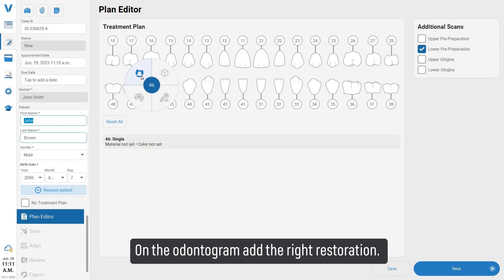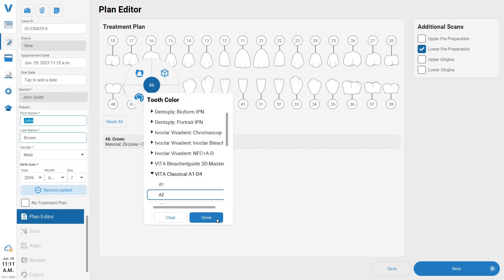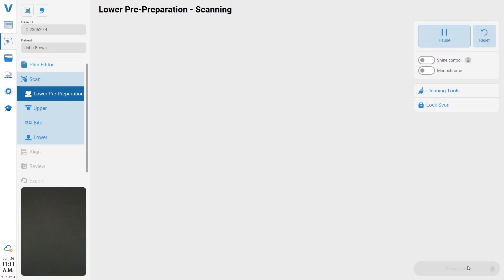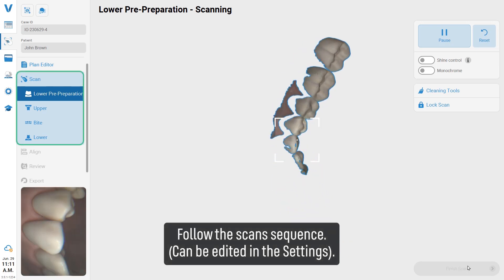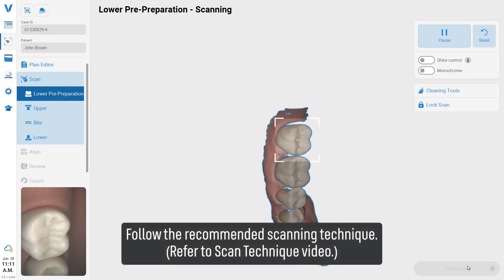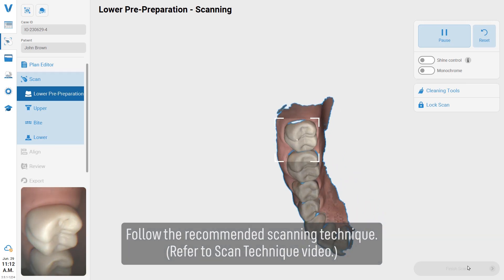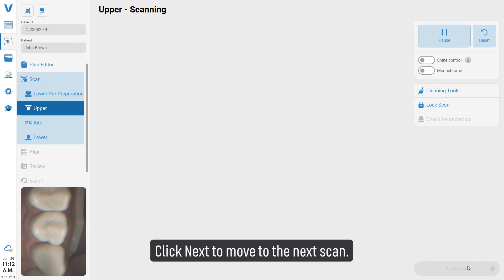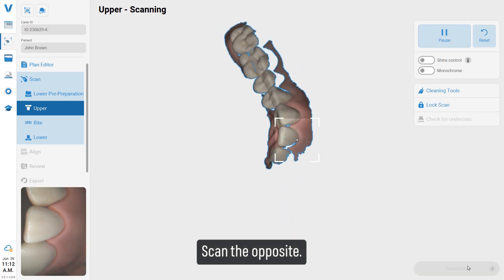Add the right restoration and click next to start the scan. Follow the scan sequence, which can be edited in the settings. Follow the recommended scanning technique — refer to the scan technique video — and click next to move to the next scan.